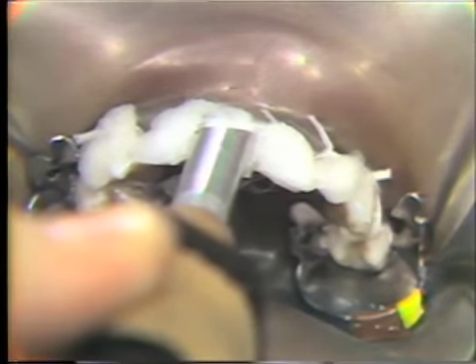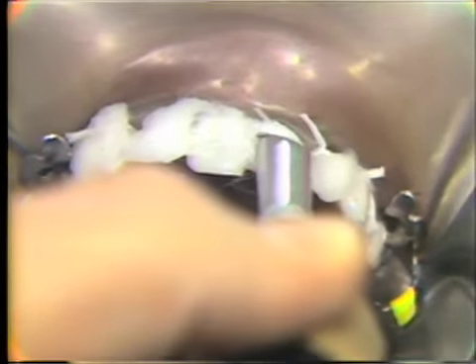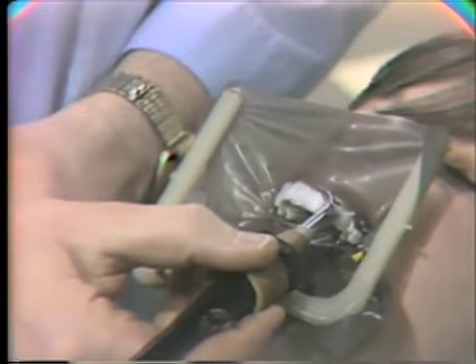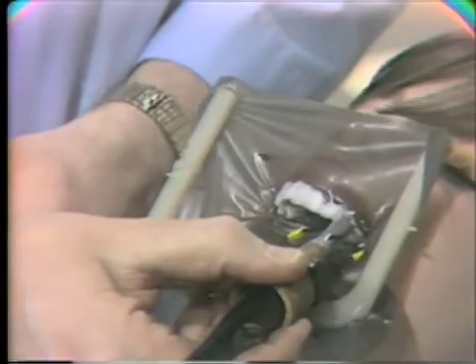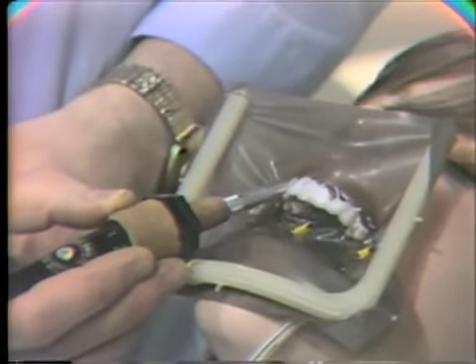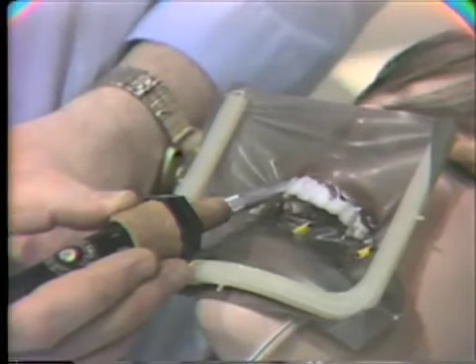By heating the superoxol thusly, we'll increase the effectiveness of its abilities to bleach about 20-fold. Oh, she felt that one a little bit. Now we usually bring the patient back for 3 appointments.